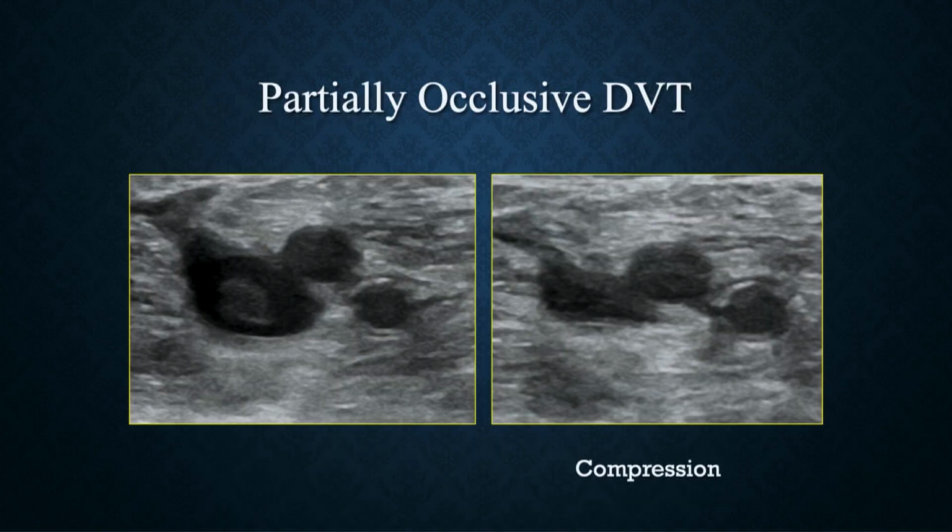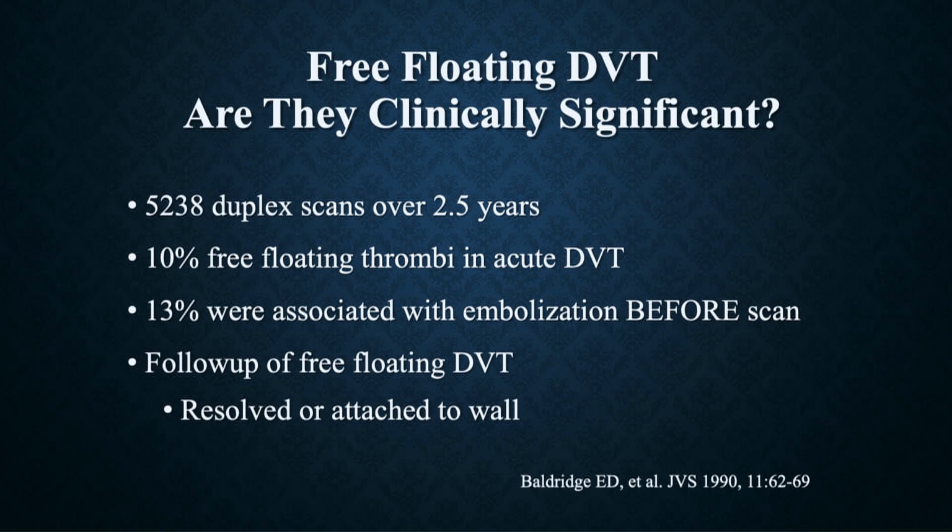I will tell you, I will do a gentle compression of it to document that there is thrombus there. I wouldn't go out of my way to try to dislodge it, but I will document that it is non-compressible, as I do in this case. Studies have shown that there's a very low rate of causing embolization of free-floating thrombus.